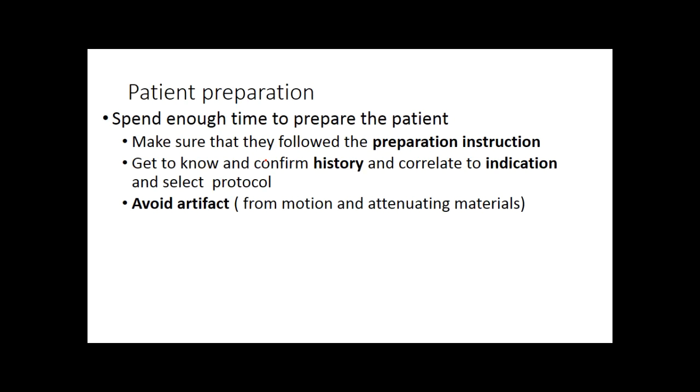You communicate with the patient regarding their preparation and instructions. You confirm the history and correlate it to the indications. Select the proper protocol. Communicating with the patient also makes you avoid artifacts from metallic and plastic articles.